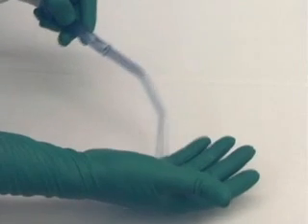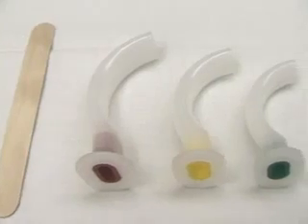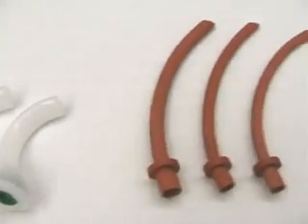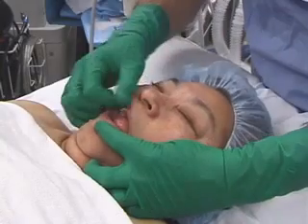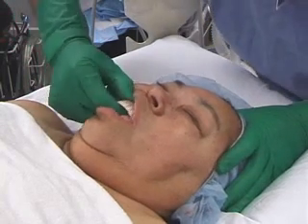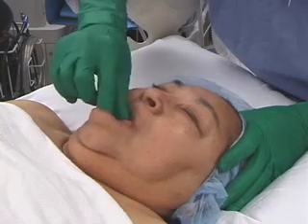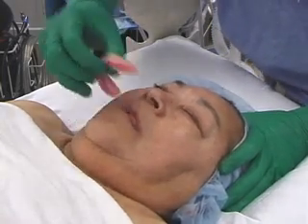Whenever possible during face mask ventilation, suction should be readily available. Airway management adjuncts such as oral or nasal airways may need to be used. Before beginning face mask ventilation, it is prudent to examine the patient's oral cavity when possible. Smaller dental prosthesis or other foreign bodies can be swallowed or aspirated. One may consider leaving full dentures in place to provide a better mask seal.